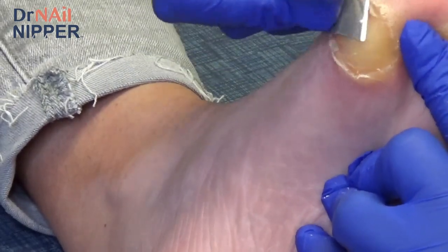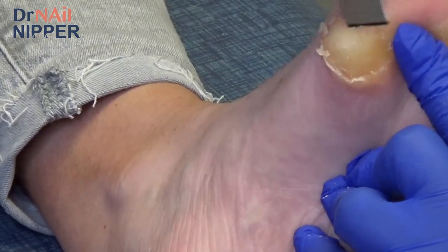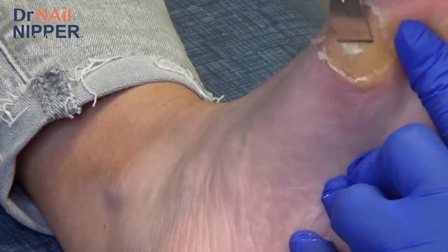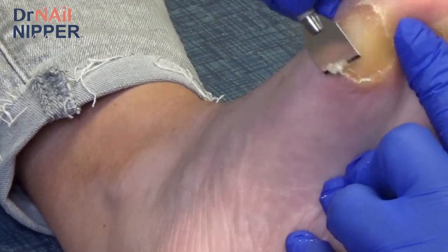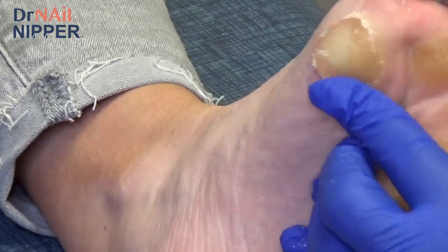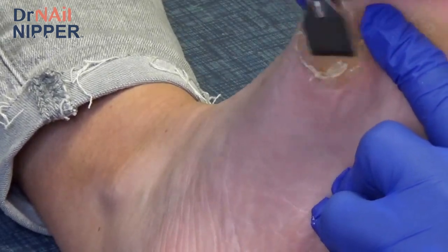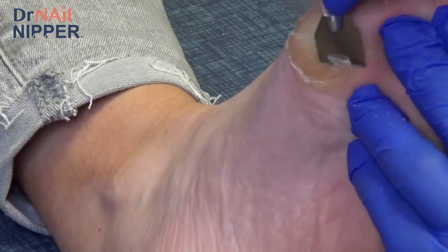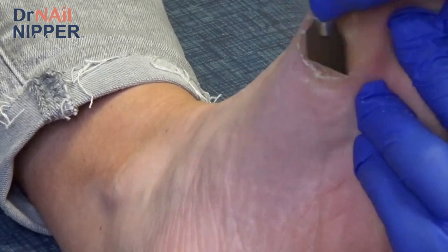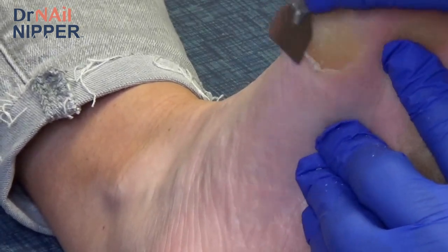So I'm going to do the big chunks with this blade, and then I'll come back with my smaller one. Okay. Kind of fine-tune it a little bit. So you don't have any other patients like this? Not right now. Like I said, I used to. I had one man who used to come, and every place that there was pressure on his feet, he had calluses like this. And he would come every 6 to 8 weeks for the same thing. And there isn't a cure. It's just how you manage it.